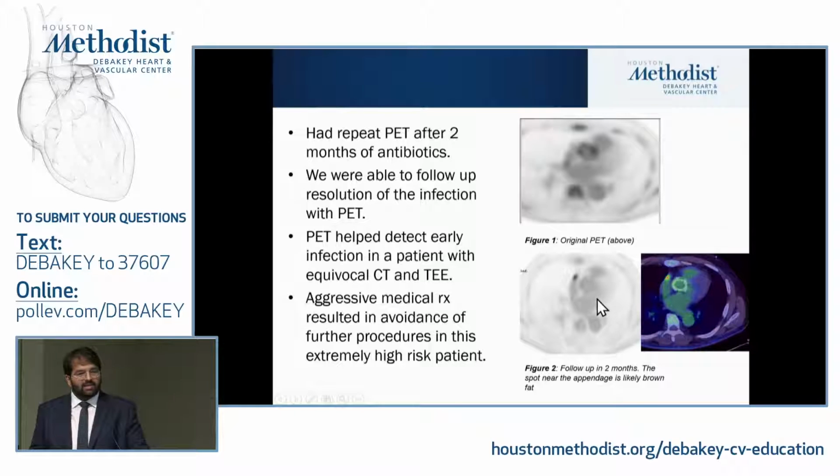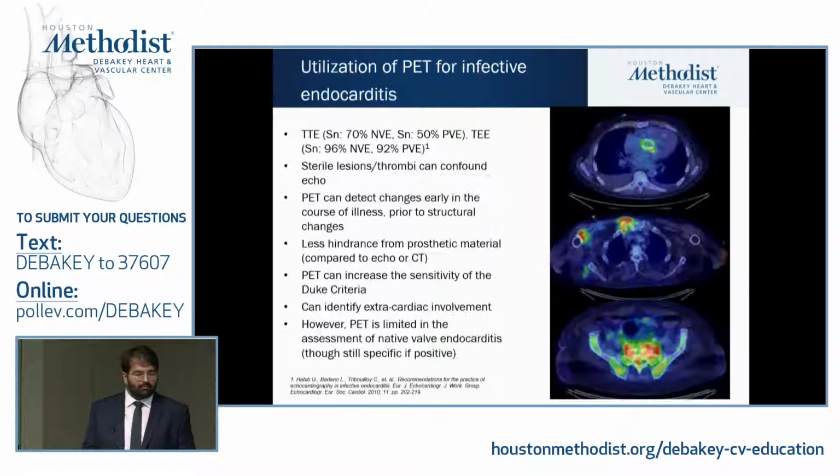And I think this case illustrates well how PET not only picked up an early case of endocarditis before TE or CT could, but it also prevented this man from having any more surgery or any more invasive procedures done, and it gave us an opportunity to follow up on it.